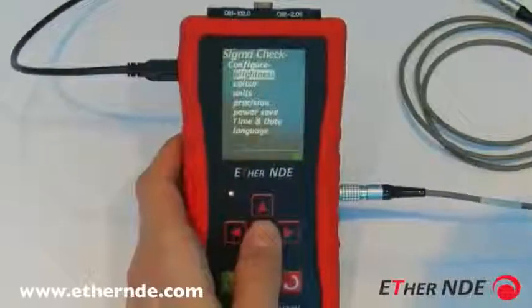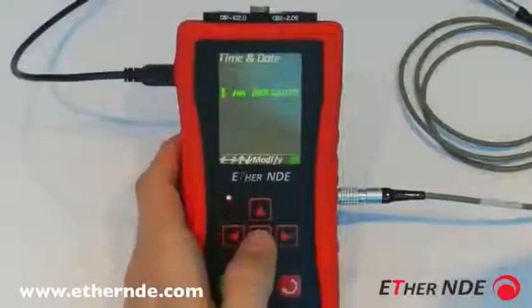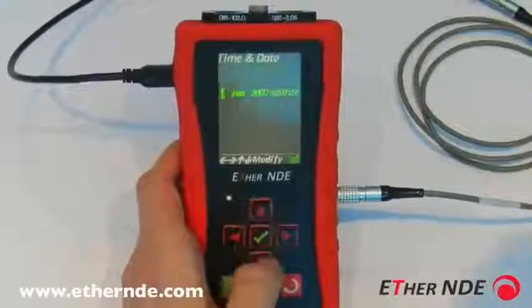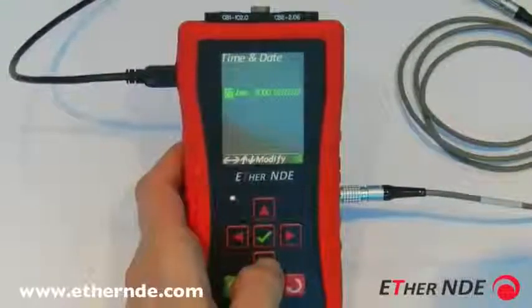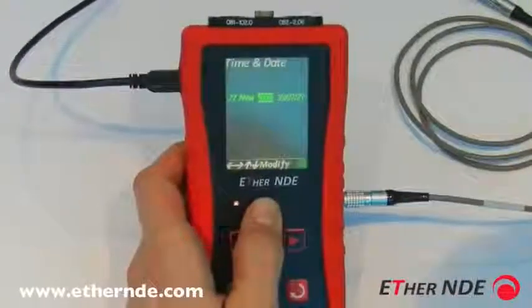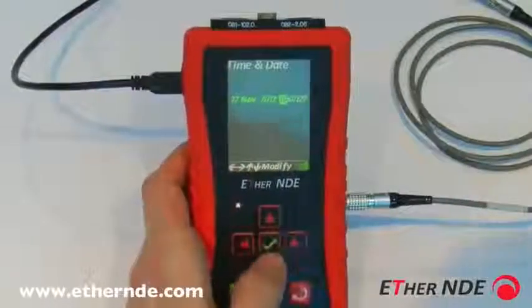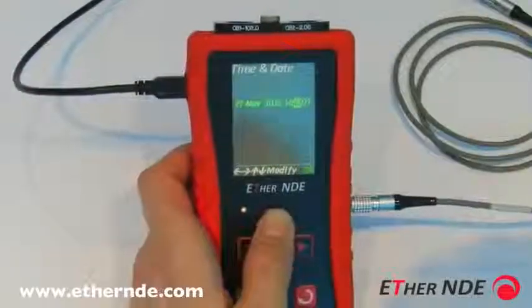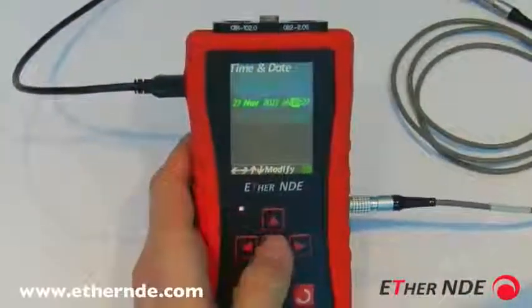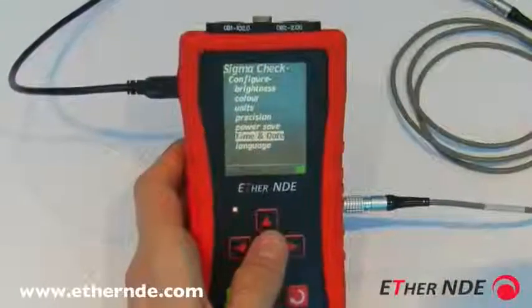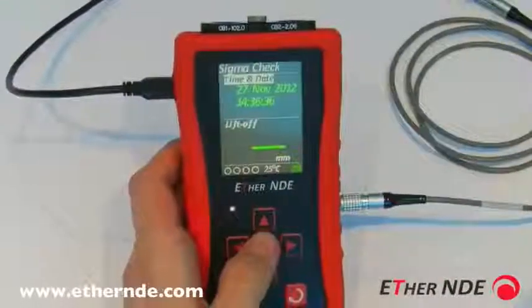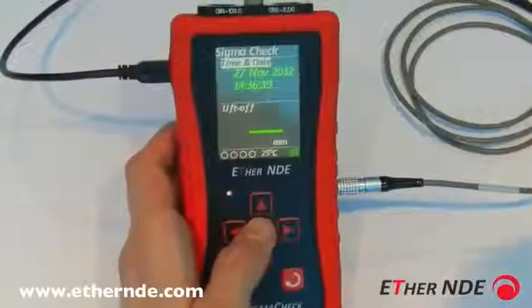Go across to the configure submenu and down to time and date. You can see the 1st of January 2000 is shown again. The first value is highlighted, so simply use up or down to change to today's date — the 27th of November 2012 — and set the time to 2:36. With that set, tick to accept. To confirm, go back to the reading screen and you can see the time and date is now correctly showing 27th of November 2012 at 2:36.